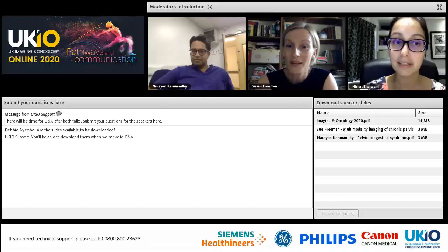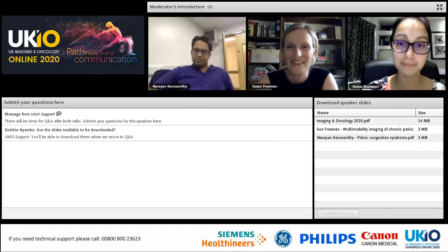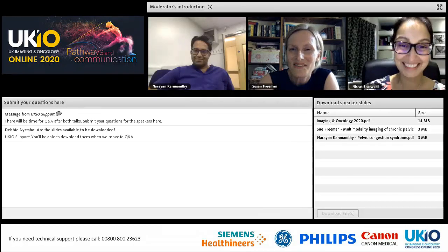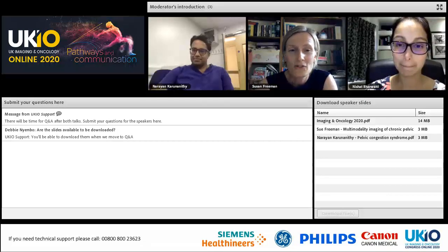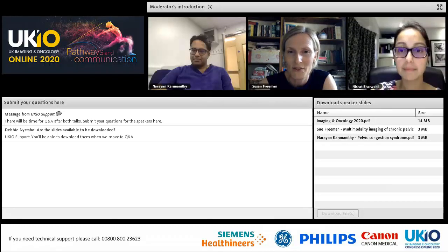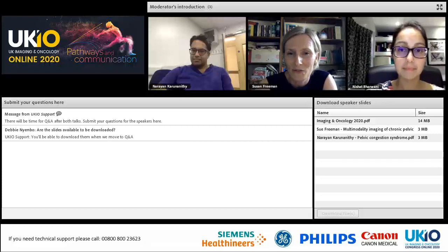Okay, well, can you hear me first? I think it's just to say that when you see that on the transabdominal view or even on the transvaginal view, you should really make an effort to look for endometriosis, because that fibrotic retroflexion is a really typical finding in ultrasound.